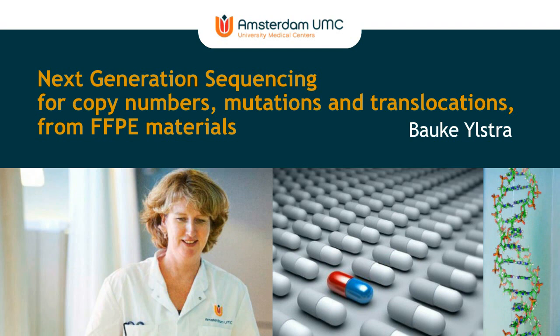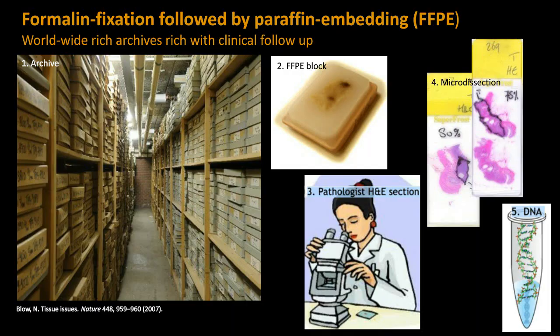So for us in research, FFPE materials are of particular interest since there are large archives of FFPE tumor materials worldwide. This is actually the archive on the left of the Amsterdam UMC. And the neat thing of those archives is that they have extensive clinical follow-up. So very cool to do research with.